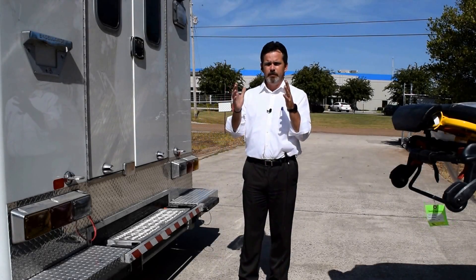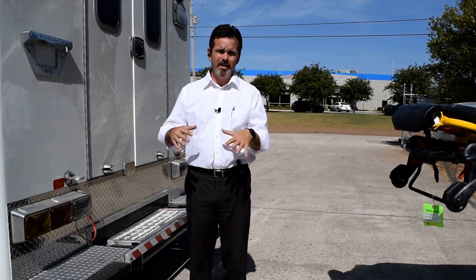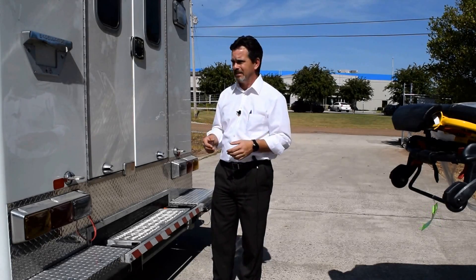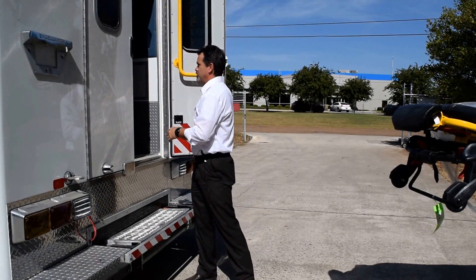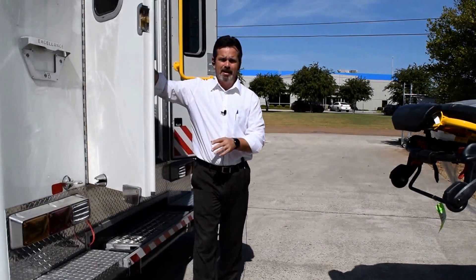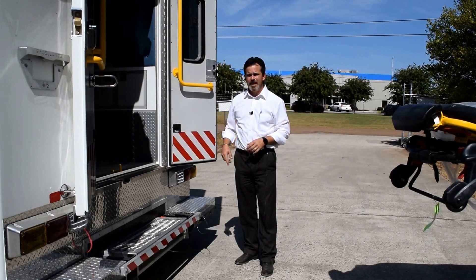This demonstrates how the air ride system dumps for loading the cot. Once the truck is parked and on scene, you open up the rear doors. When you open the left rear door, it will automatically dump. You can override the dump feature with the switch labeled 'air ride override' — hitting that will bring it back up.